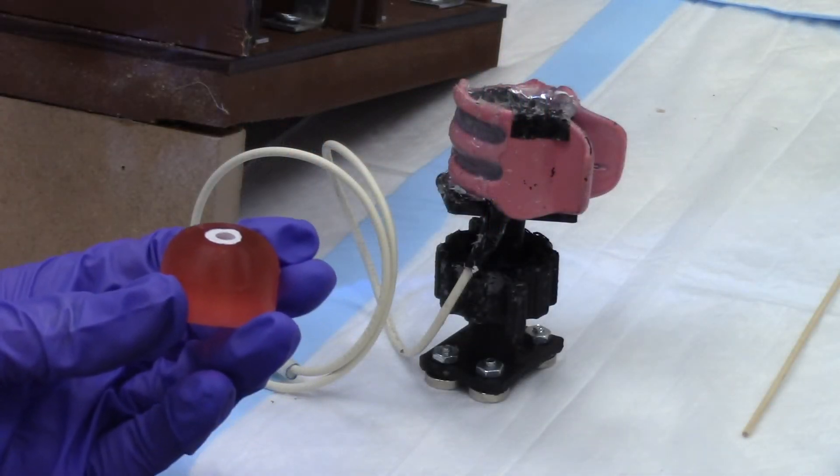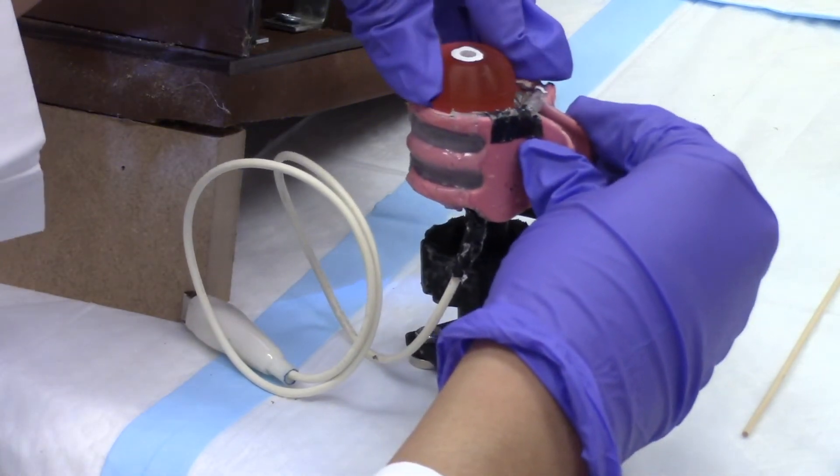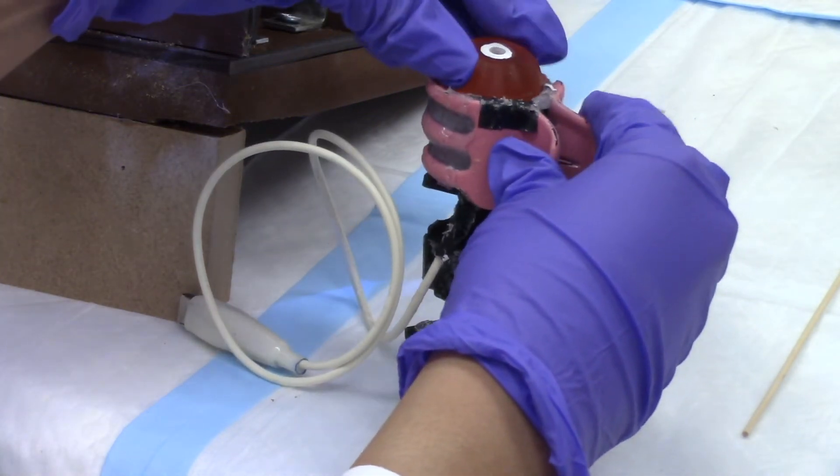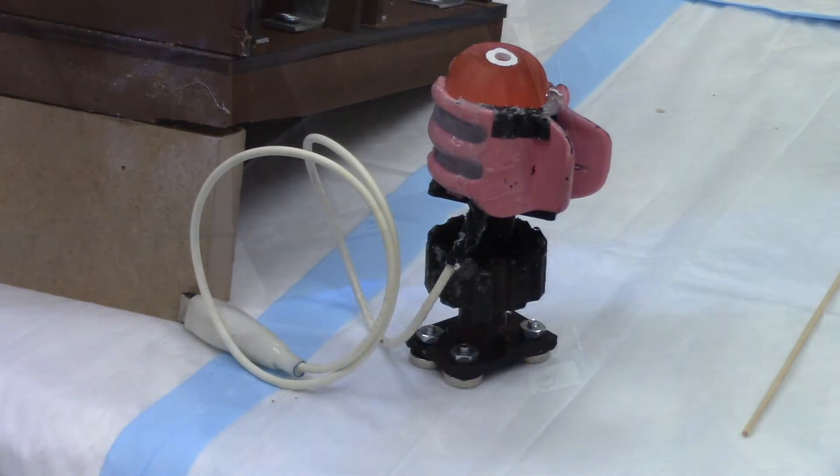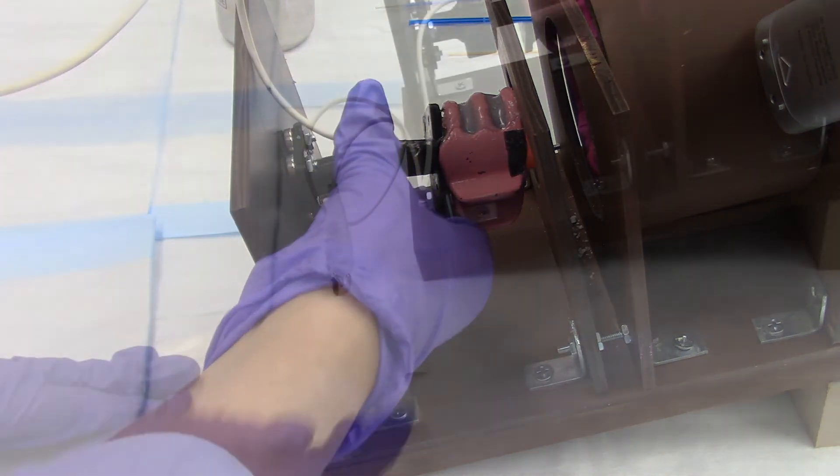Finally, gel models can be used for LEEP training. The gel models used here have a white lesion painted in the center. These models must be inserted into the cervical model holder with a clamp. The cervical model holder is magnetic and is held in place by the magnetic wall at the back of the pelvic frame.